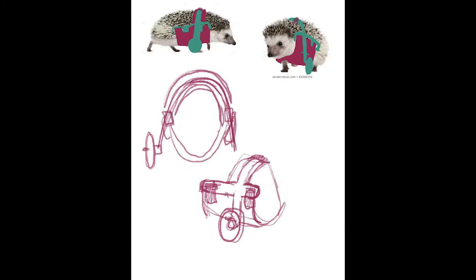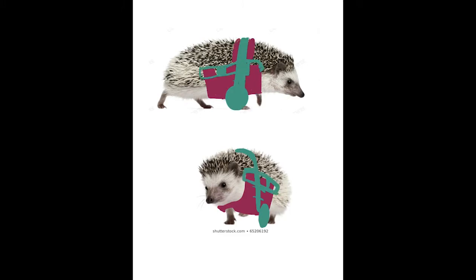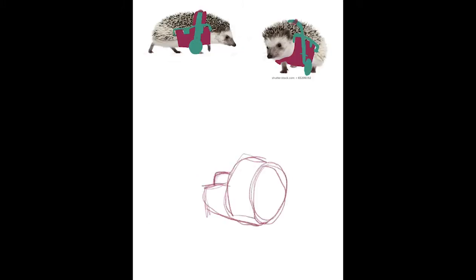This is the sketch for the wheelchair. I started off by drawing the sling, which is in the pink, and then the outer frame, which is in the teal. I wanted it to be lightweight but still have enough support to hold Molly while she was walking and eating.